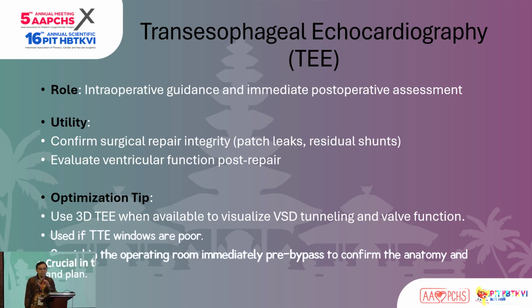TTE or even TEE can best be used with 3D as well. Nowadays, they have a lot of tools as well for echo, be it 3D. It helps us to visualize the VSD tunnel as well as valve function. And it's crucial in the operating room immediately pre-bypass to confirm the anatomy and the plan.